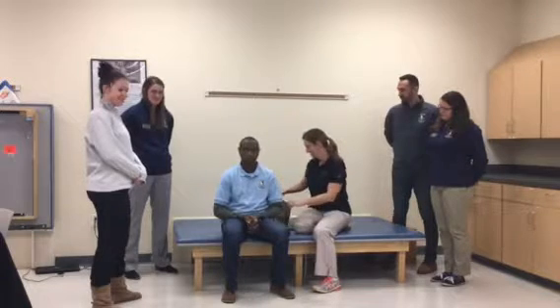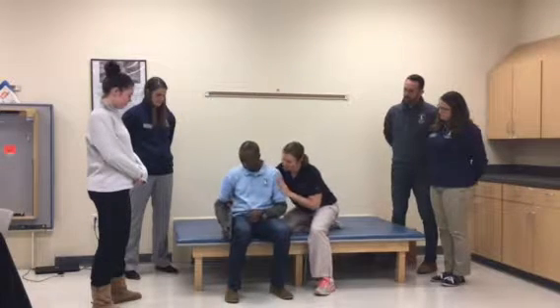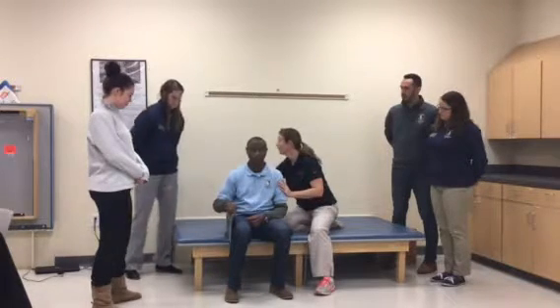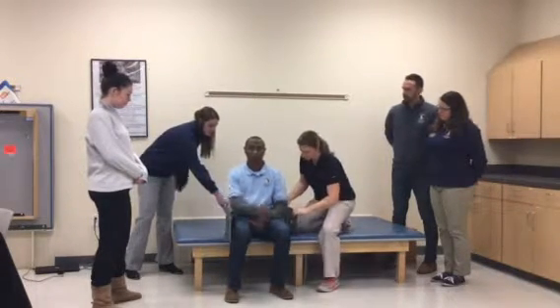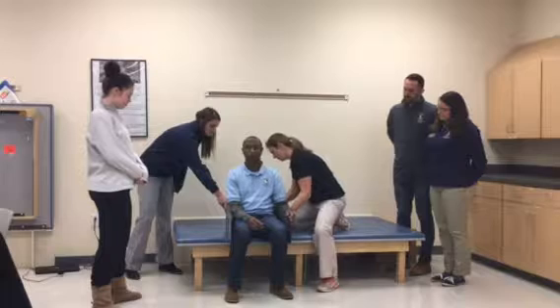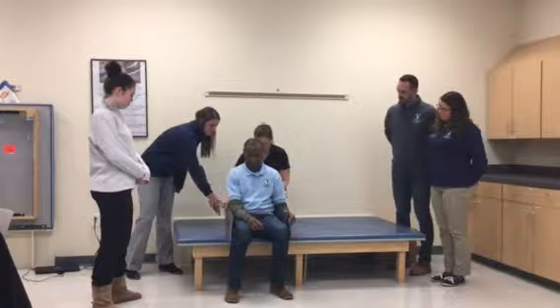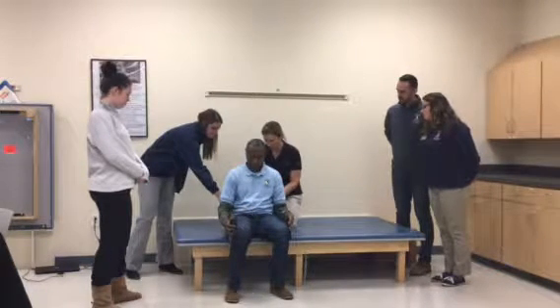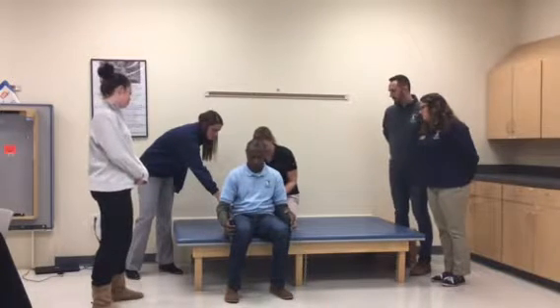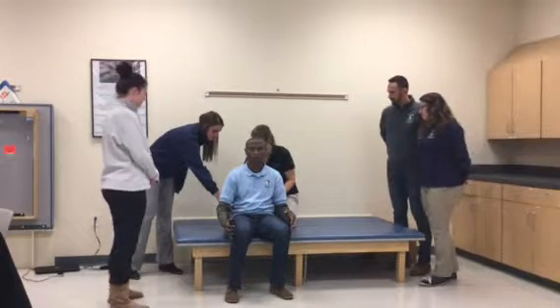First, Melinda is going to measure the seat width for the client. We find it very helpful to have sliding boards or a solid surface on either side of the hip. When you line them up, you ask the individual to move their arms out of the way so that you can measure from one sliding board or one solid surface to the other. She's showing Lauren how to measure the actual width of Dixon's hips so that we can determine what size of wheelchair would be necessary.